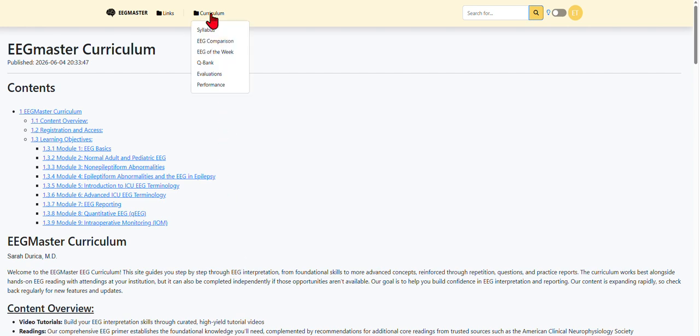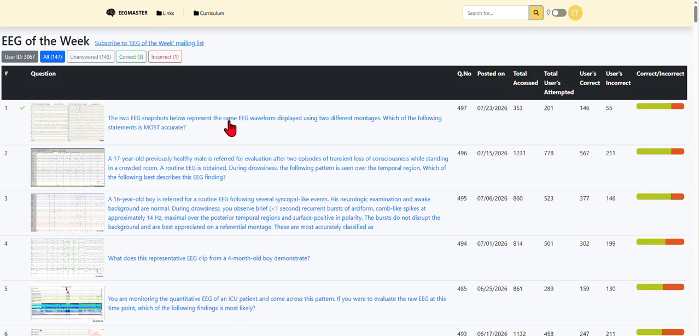Finally, again, one of the unique features of our website is that we have a pretty extensive self-assessment option for trainees. In addition to the topic-based questions that we already talked about in the Atlas, we have an EEG of the week that trainees can do. A new question comes out every week, and that does get added back into the topic-based practice questions, but learners can go back and work through old questions, and they can do that in different ways.